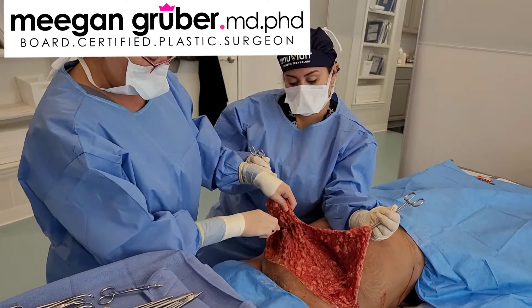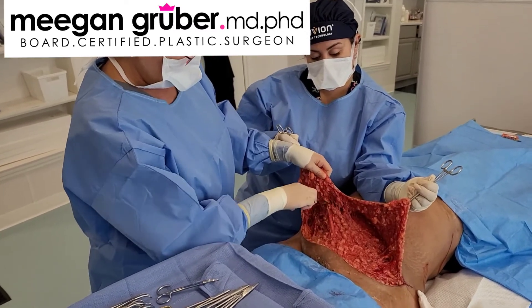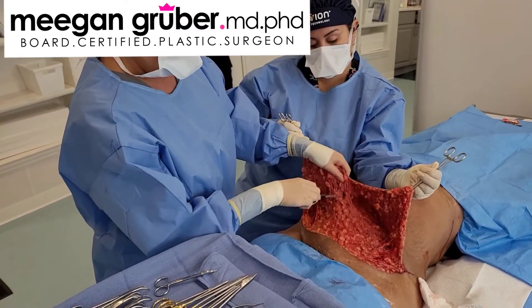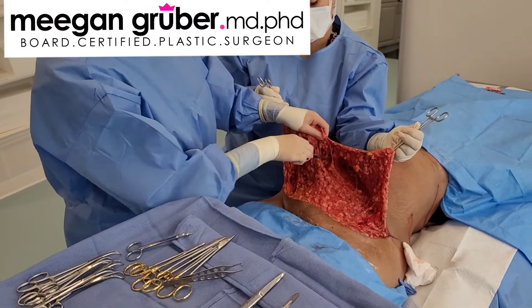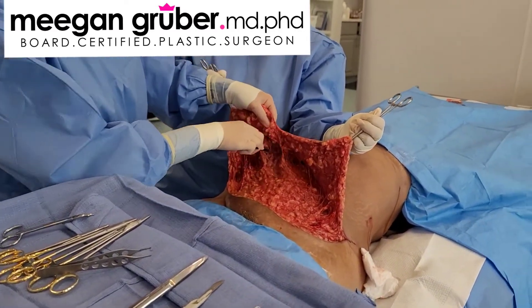The blunt dissection is very easy once you've done lipo. It's pretty much bloodless — there's no bleeding here, which is pretty unusual when you're doing a tummy tuck to have no bleeding at all. There's no need for cautery.